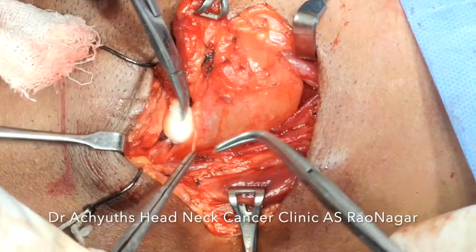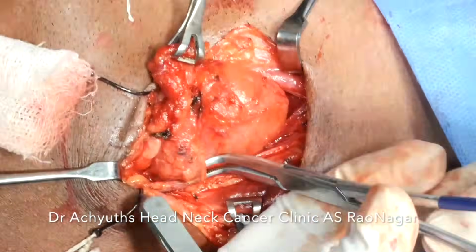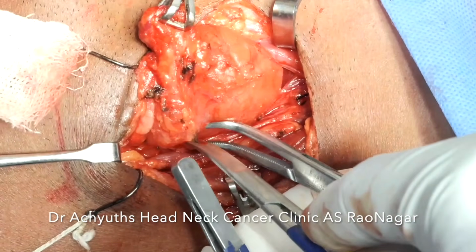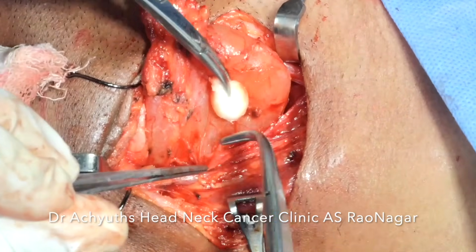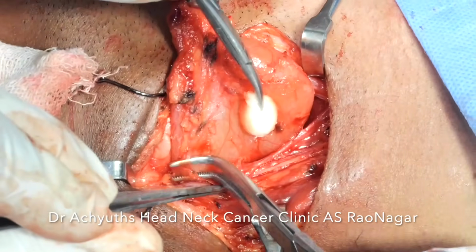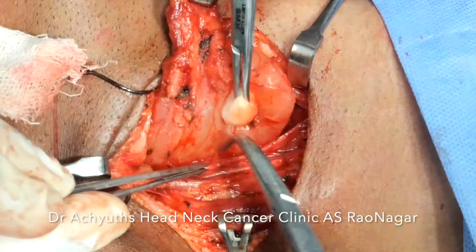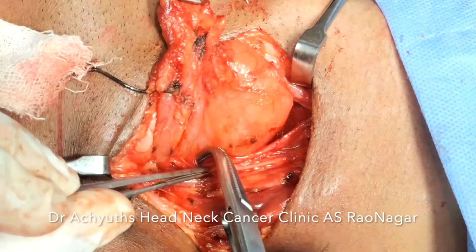Since we are a little deep into the structures, I would prefer using a right angle forceps, because the angulation to dissect is a little difficult here with mosquito forceps or Jake or whatever we use, and by far everybody has their own favorite instruments. Right angle is that favorite instrument for me.